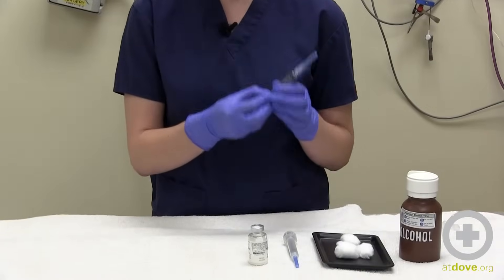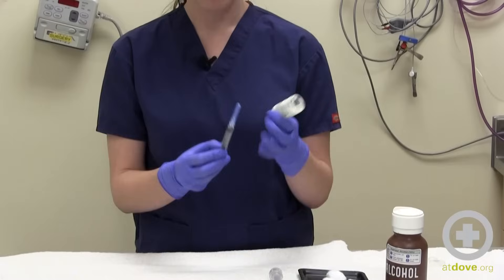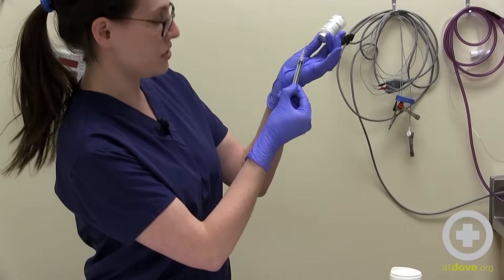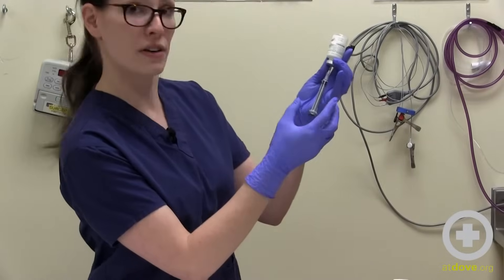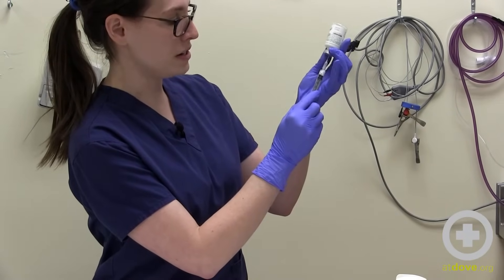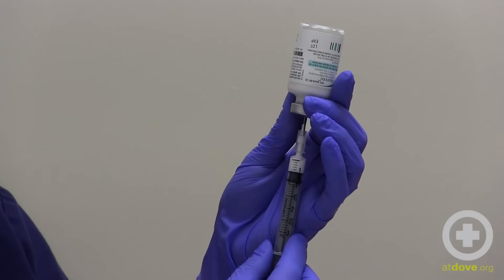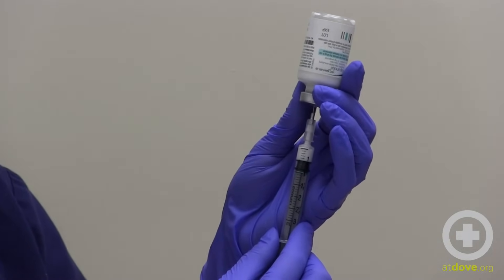Here we're going to be drawing up a half a mil. Take your bottle and put it upside down. You're going to carefully take your cap off and then carefully insert your needle into the center of the vial, just so it goes in. Then you're going to pull back on the plunger until you get your syringe to be exactly at the half line. You want the top of your black syringe plunger to be right at the mark that you're drawing up to.